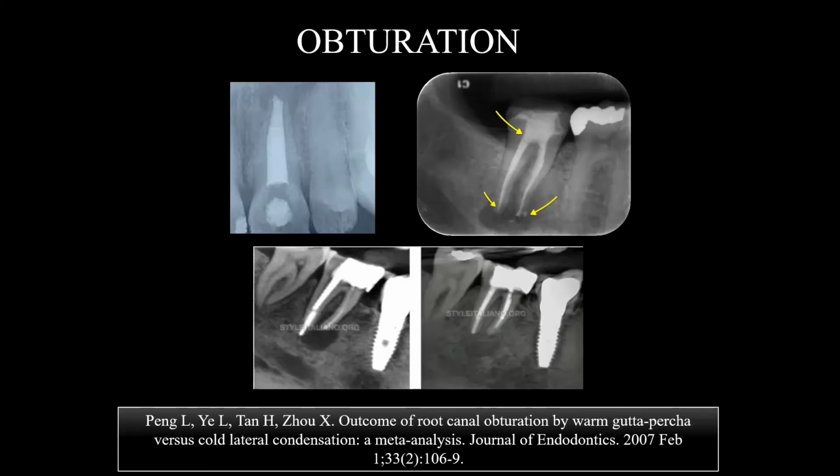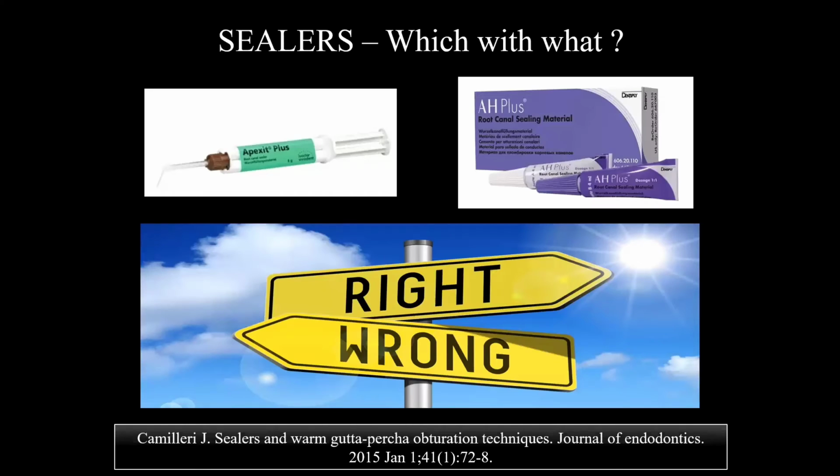Obturation is the critical step of the root canal treatment. With the enlarged arena of newer equipment and better techniques, it has become a predictable paramount to success. Cold lateral compaction technique, widely used in the earlier era, didn't do justice to wide canals and created voids. Now the thermoplasticized technique paves the way for better outcomes in regard to wide canals, failed cases, and cases where healing of the periradicular tissues failed after successive attempts.